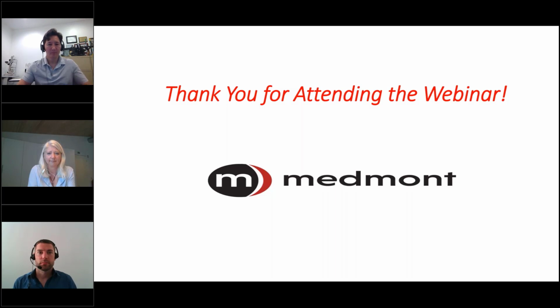I highly recommend, and as I say, there is a dry eye function within the Medmont Topographer, and it's a very valuable tool in helping to assess a dry eye patient, kind of one of the first steps. It's a good tool, and it's a highly recommended tool as well too. As I say, it's a lot more accurate than what you're going to be getting from putting fluorescein into the patient's eye and doing it that way.